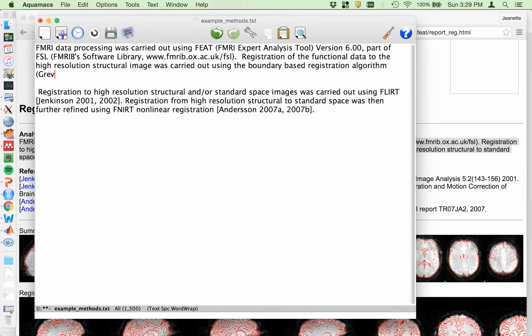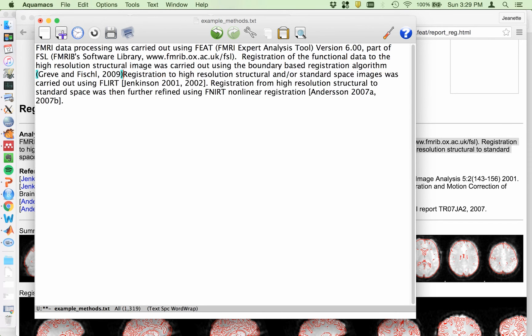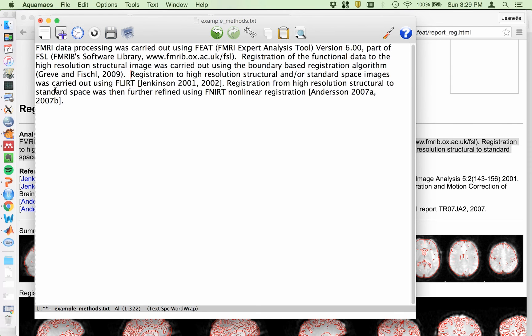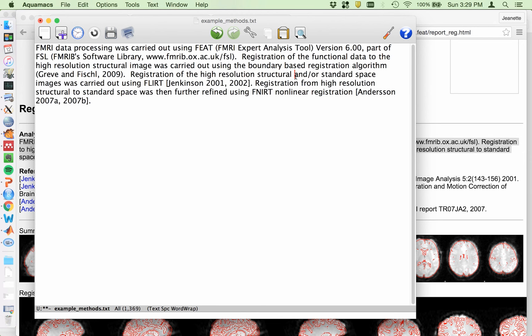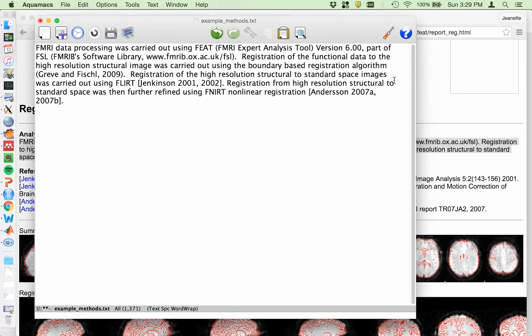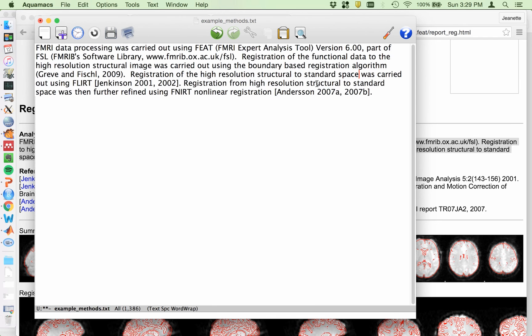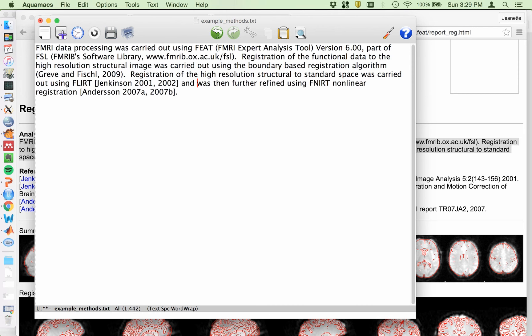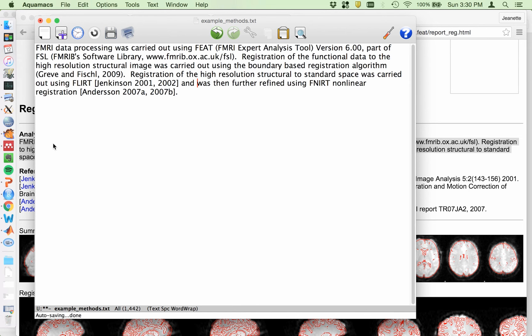And then you would put the reference here. So what did I say? Grieve and Fischl, 2009. Okay. And then I'm going to back this up. Registration of high resolution of the high resolution structural to standard space was carried out using FLIRT. And then I'm going to say, and was then further refined using FNIRT. So I just had to delete a little bit because that sentence was trying to cover both the registration of the structure, I'm sorry, the functional to subject structural and structural to MNI. And then they add this extra bit about FNIRT. So I just deleted that.